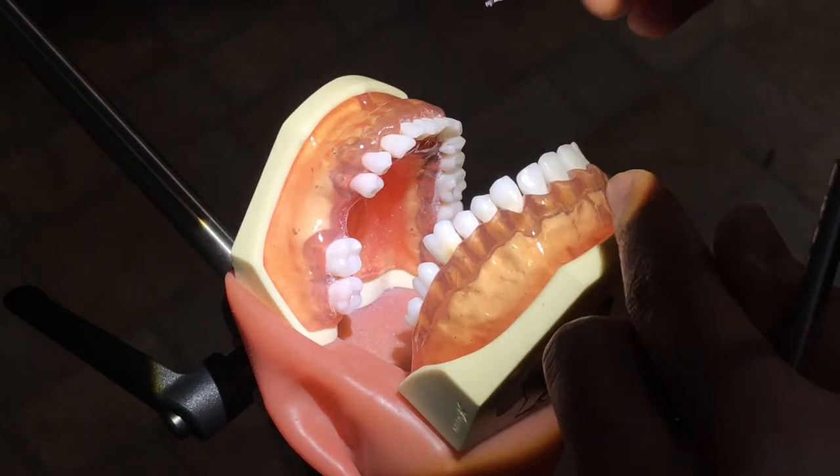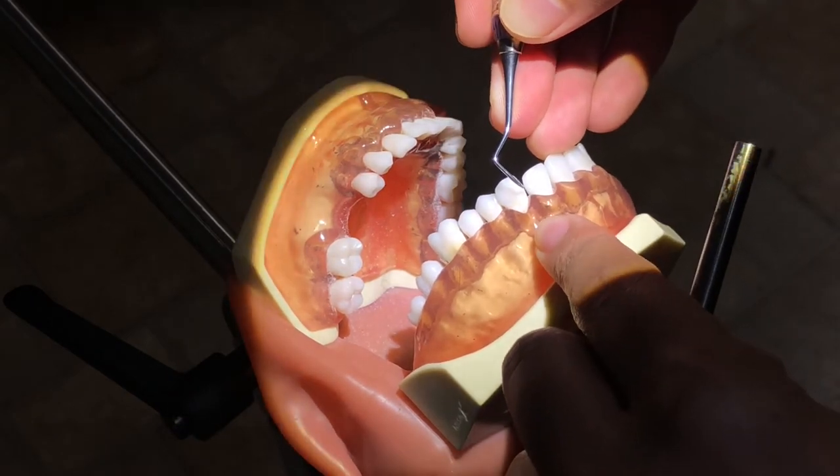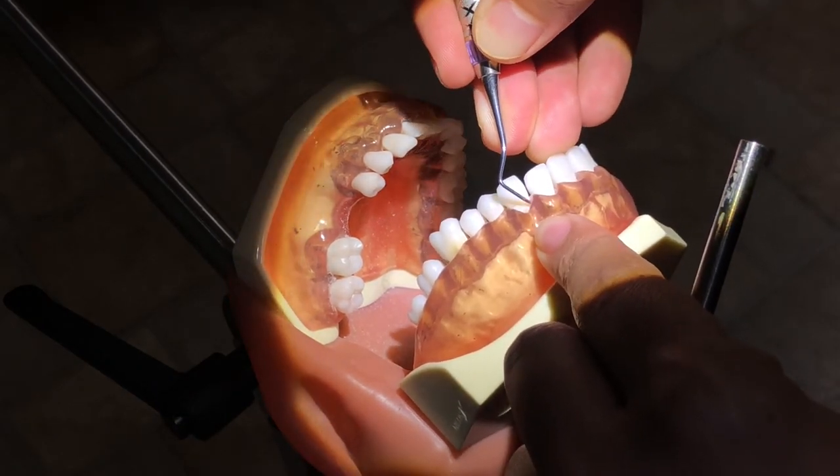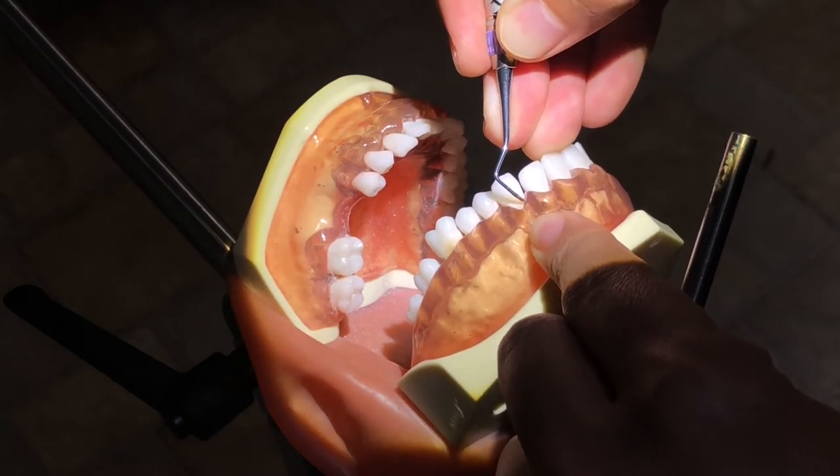Using a universal curette, I'll be instrumenting tooth number 11, the mesial buccal surface. I'll start on the mesial line angle here. This is tooth 11. Then insert the blade, angle it, and activate.